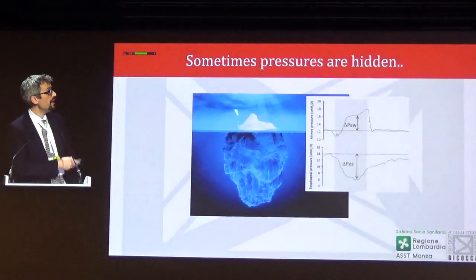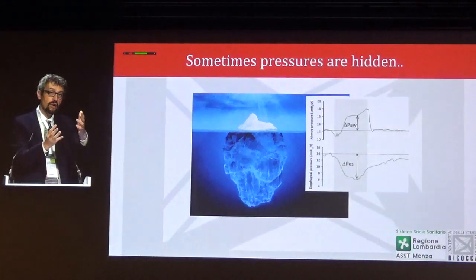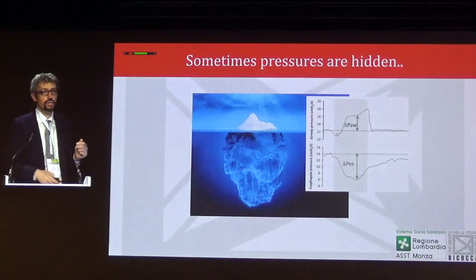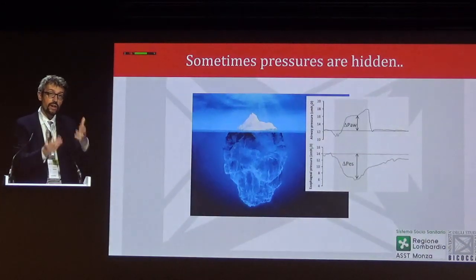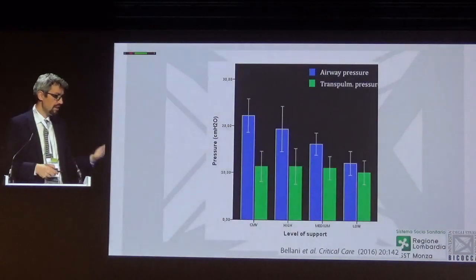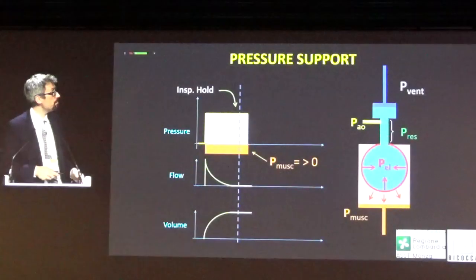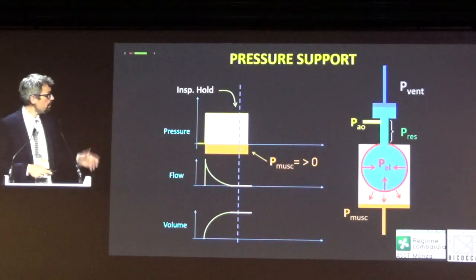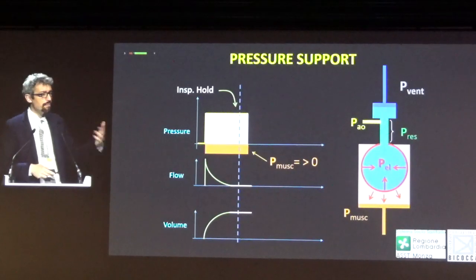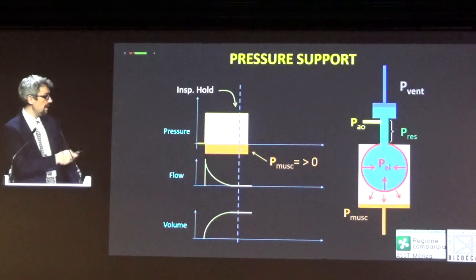Or we let the iceberg out of the water where we see it. We let the entire pressure in the airways where we can see it. How is this doable? We have been using this technique in our ICU for several years. There was a publication by Giuseppe Foti about 20 years ago on this, and now we have reappraised the potential clinical relevance of this.